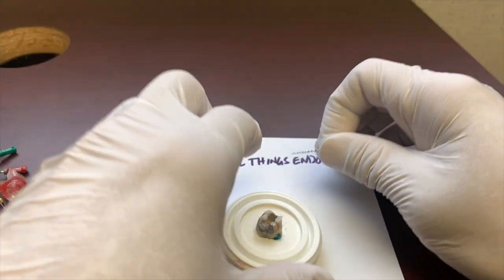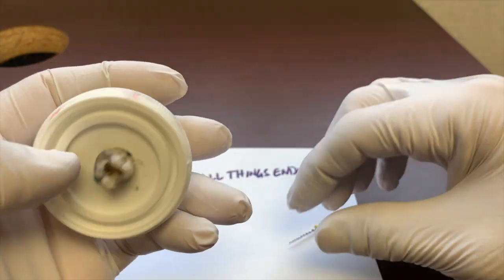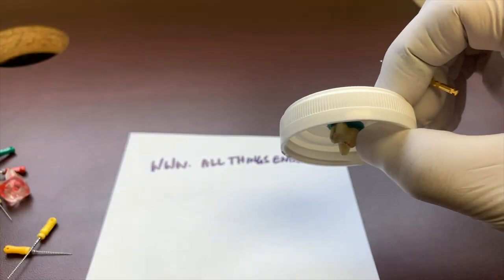But let's talk about this case here, where, like Huma said, and I've been wanting to do this video for a long time, I'm just going to do it with my iPhone versus using a microscope, and we'll see how it goes. So here are some extracted teeth that we've mounted. They're for a course I've posted online.